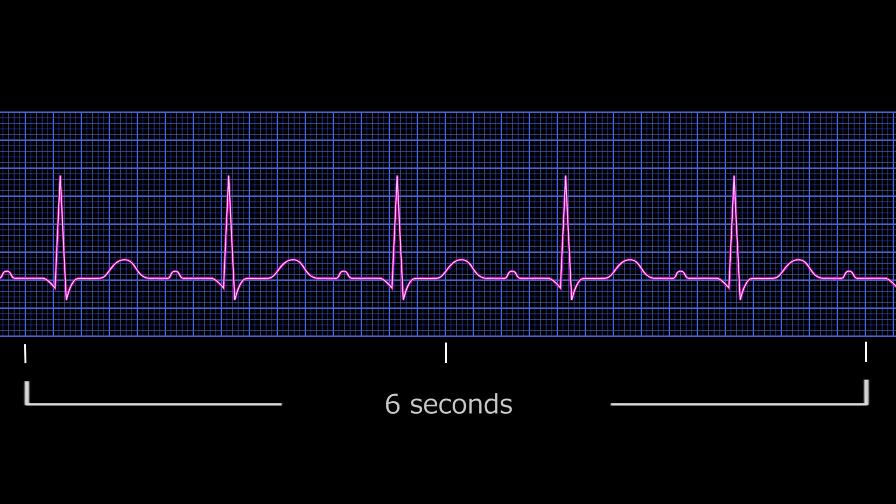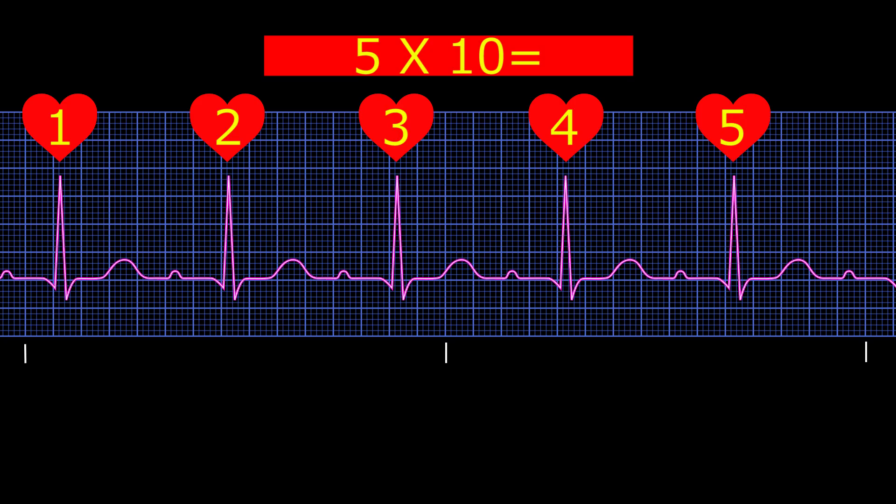Here's a six second strip. How many beats are in this strip? 5 times 10 equals 50 beats per minute.